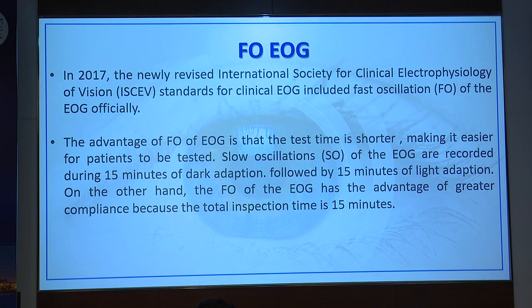Now, these were all slow oscillation EOG. What is fast oscillation EOG? In 2017, ISCEV standards have included FO officially. The advantage is that the test time is shorter, making it easier for the patient to be tested.